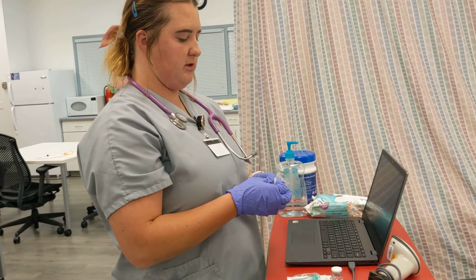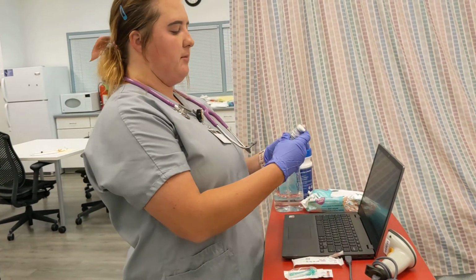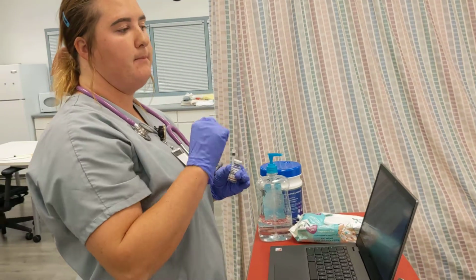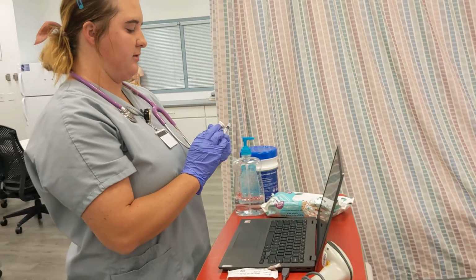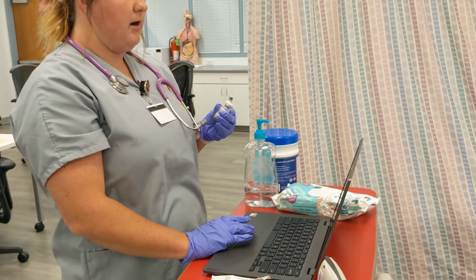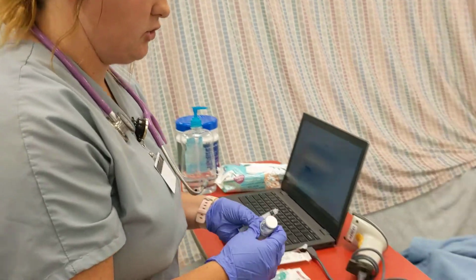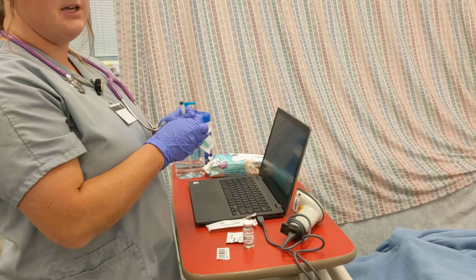And I am going to do my first check right now since I'm just getting it out. So I'm going to check that it is ketorolac tromethamine, that it matches right here. We have the right patient. We have the right drug, our ketorolac tromethamine. The dose, we're going to be drawing up 1 milliliter. Our route is intramuscular, and the time, it says stat, so we're doing it right now. So we've done our first check. Everything looks great. We have our right patient, our right medication. We're safe.